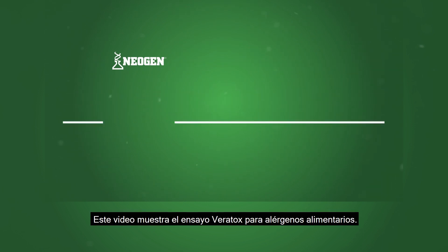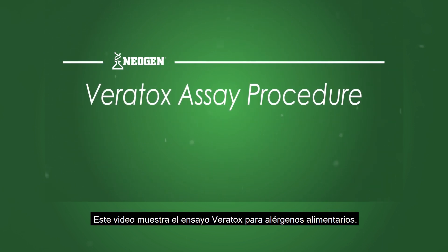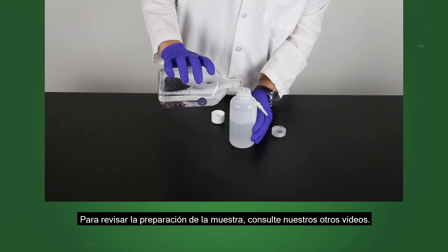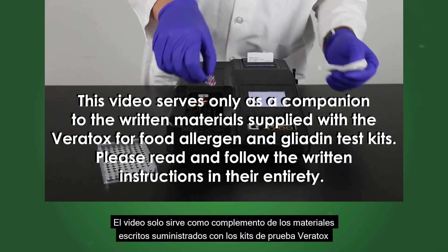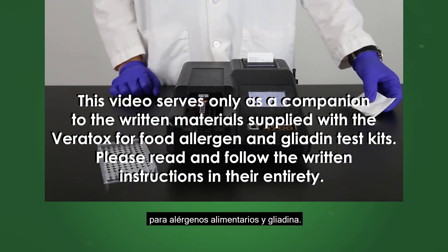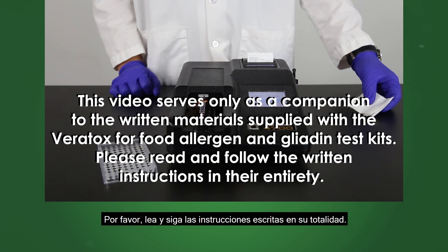This video demonstrates the Veritox assay for food allergens. To review sample preparation, please refer to our other videos. This video serves only as a companion to the written materials supplied with the Veritox for food allergen and gliadin test kits. Please read and follow the written instructions in their entirety.